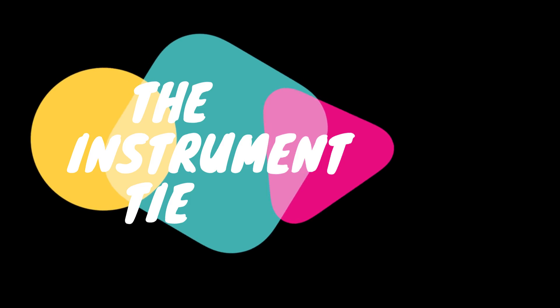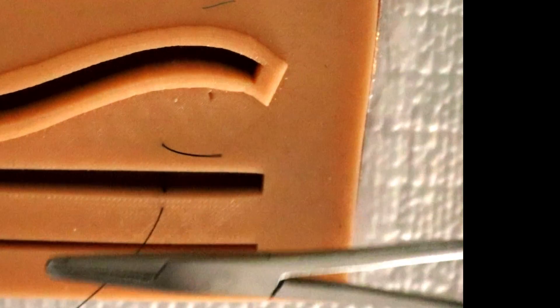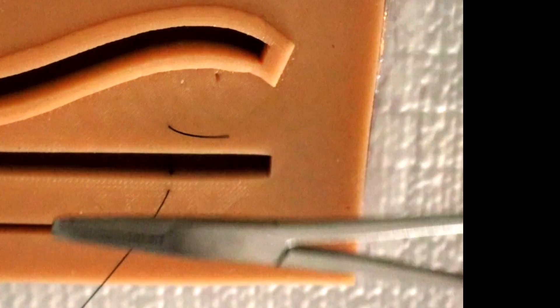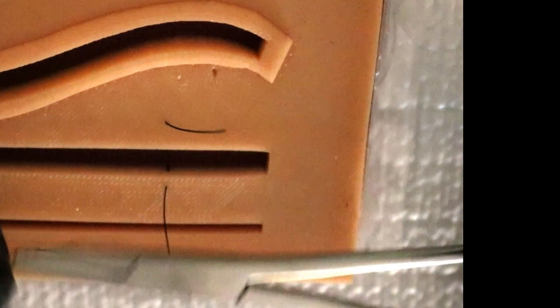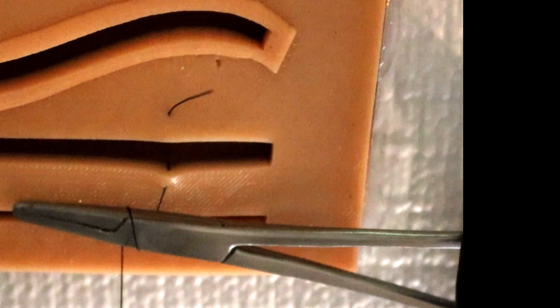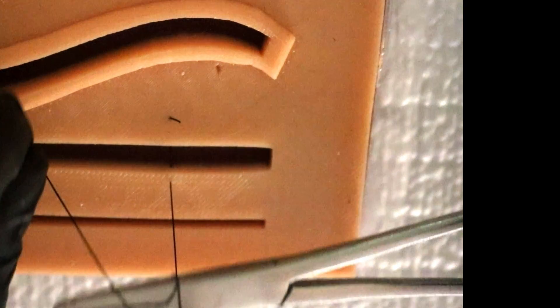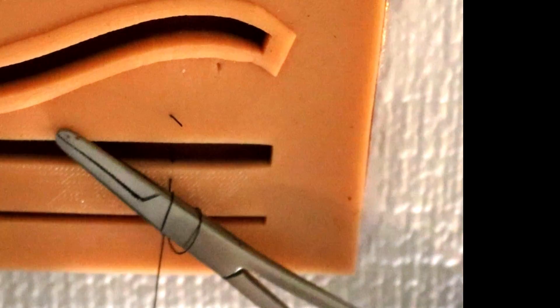Okay let's get back into the instrument tie. Here is a slowed down video of how we're gonna do it. So the needle driver goes right in the center right in the middle between the two loops there. See the two threads? Alright surgeon's knot. One loop. Two loops. You see that? That makes it a surgeon's knot.